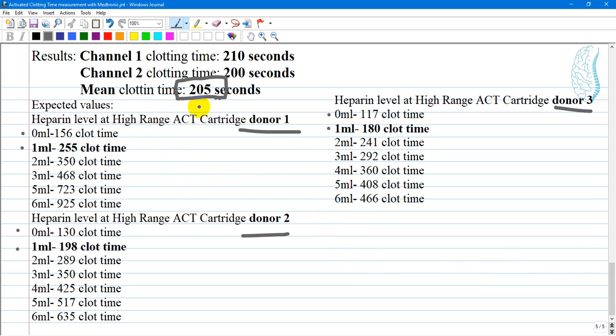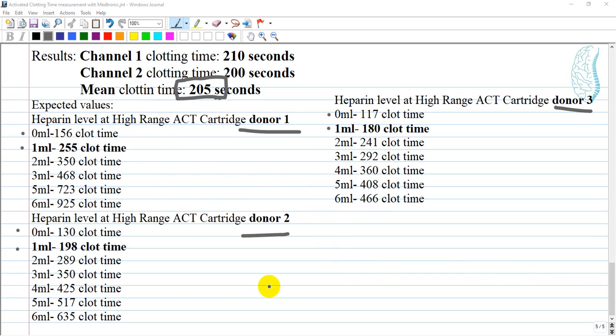We are measuring the time of formation of the clot, which impairs the optical view of the background of the cartridge. Thank you very much and have a great time.